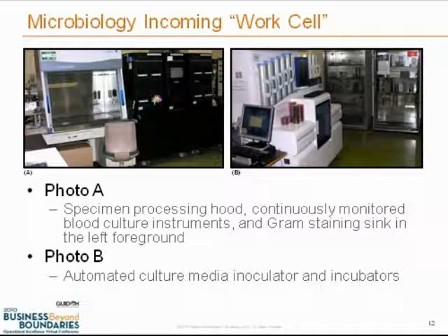Photograph A, the upper left-hand photograph on this slide, shows part of the incoming work cell. You can see the specimen processing hood on the left side, and then our continuously monitored blood culture instrument adjacent to the hood.